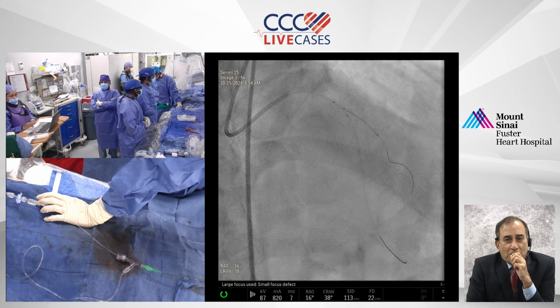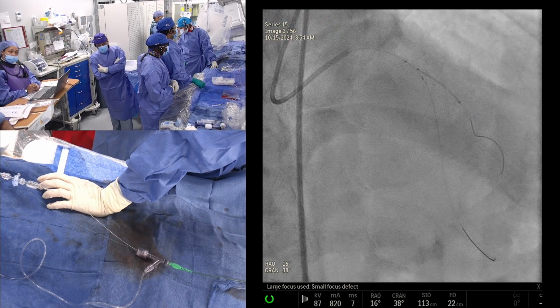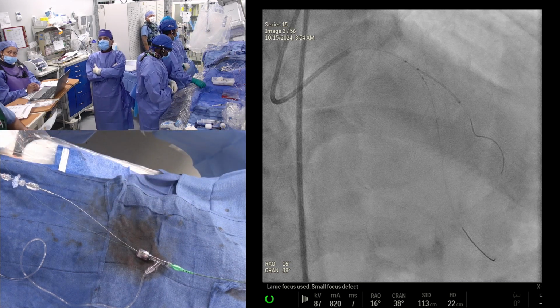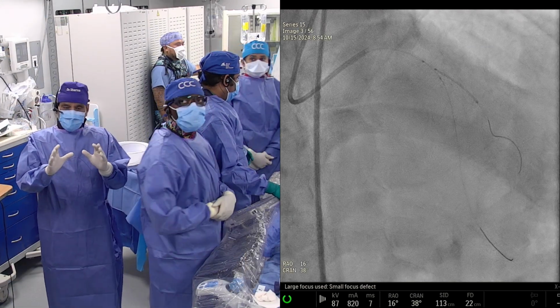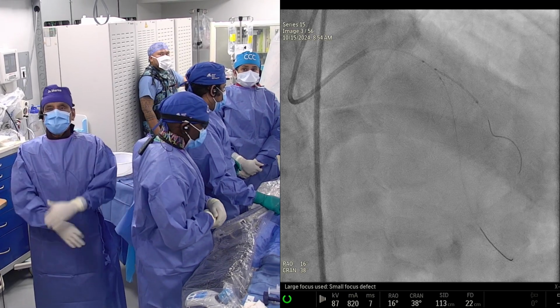Yeah. So I think basically what happened is, and people have also said, that many times the FFR changes in these patients when you bring them in at 3 to 6 months because of the various vasoactive tone. So the question basically comes down to that angiogram, and this is again the lesion which has to be like 60 to 90%.